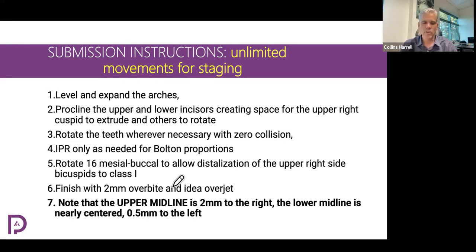Okay. You don't need to go into this much detail with the designers and stagers that we're now working with at Progressive Aligners. But when we were working with other aligner companies, we literally had to spell out every single thing and then respell it out because usually they didn't even know what we were talking about and didn't follow what we told them to do. So I'm going to go briefly through his submission instructions. Okay. Not limiting the number of stages, just saying, hey, unlimited movements for staging, however many aligners it takes, okay?